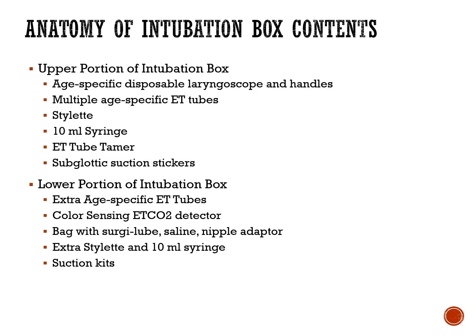You want them more accessible, okay? So a lot of these intubation boxes look like, if we have any fishermen or fisher ladies in the audience, sort of along the lines of a tackle box. You got a lower portion and an upper portion. Upper portion: age-specific, disposable laryngoscopes and handles. Again, they may be video, or they may be the traditional non-video type.